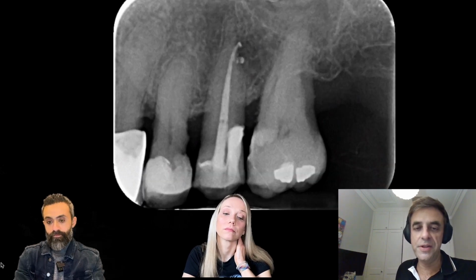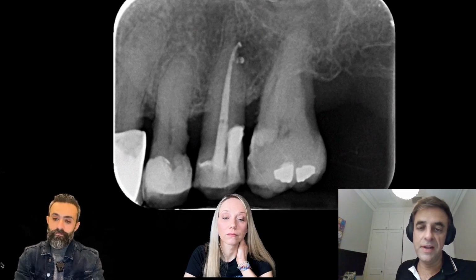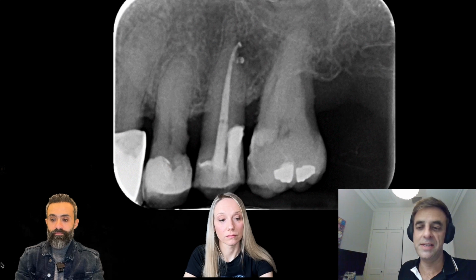So there you go. We filled the tooth, and of course, there's the apex being short of the radiographic apex, and that's an interesting thing to show because we know the reason for that. You can see that the other teeth need restorations in his mouth, so hopefully he got them done straight after I treated this tooth. But basically, you can see that this is not a problem because we were able to see this on the CBCT scan beforehand.